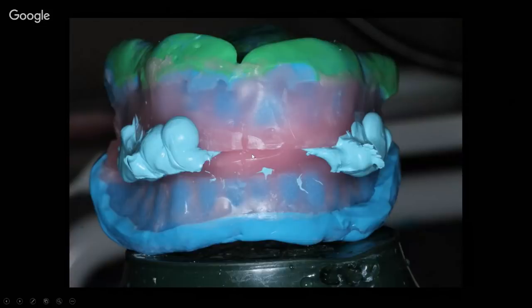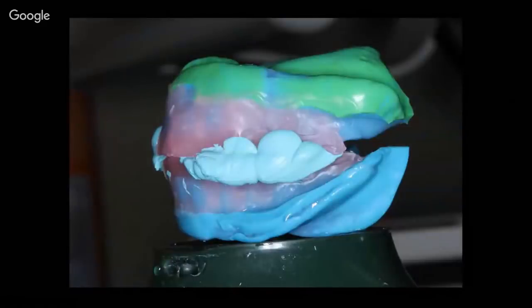And so what I have here is now all of the records that I need to go to completion on this denture. I should say to wax try-in on this denture. And so you can also see the effect of what opening the vertical on this patient had. It brings them back into more of a centric relation. We no longer have that pseudo class 3. And so everything that we need to go to set up is contained in this record, and this is the first time that we've seen this patient.